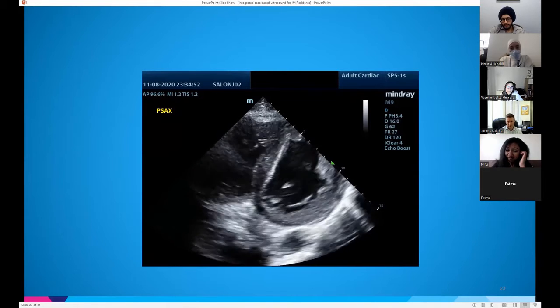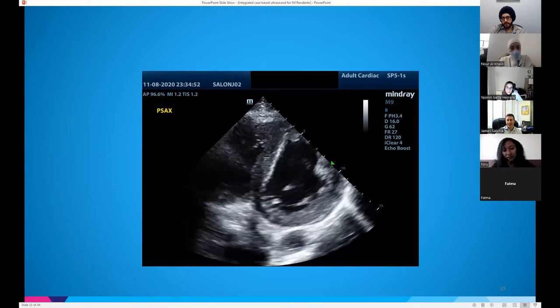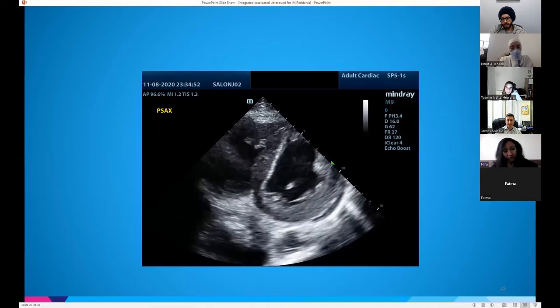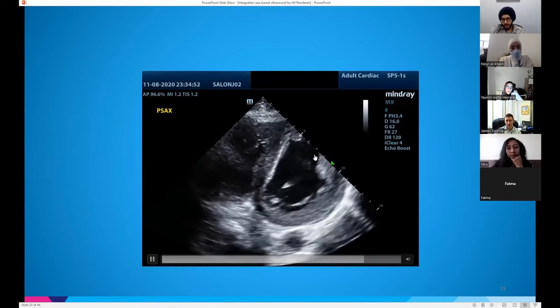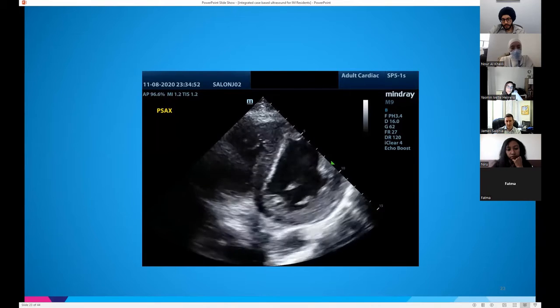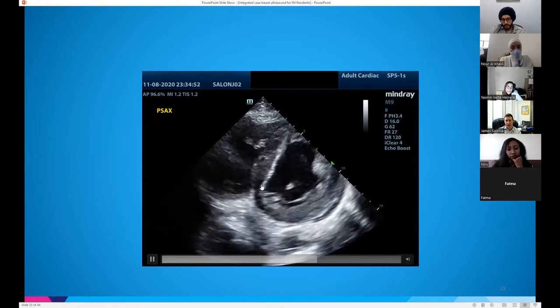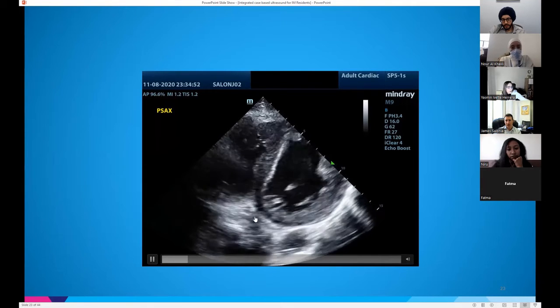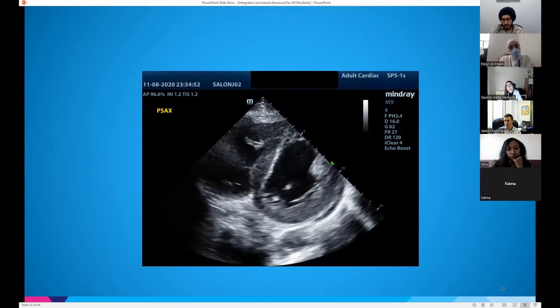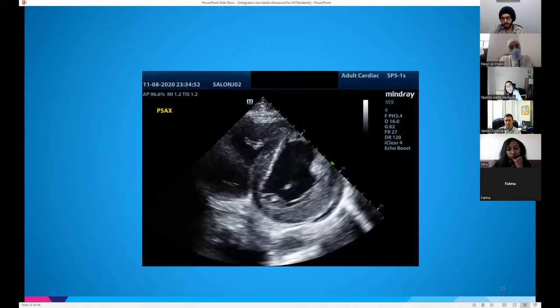What view? Parasternal short axis, and we can still see that the left ventricle motility is depressed all over. We can also see the D sign, where the septal wall is more straight. Yeah, flattened, right? So we see some flattening. So this tells you that maybe there's some what? Increased RV pressure, which might be secondary to PE, pulmonary stenosis.